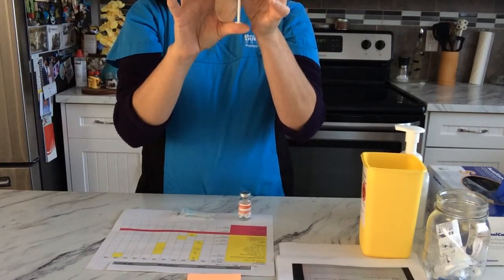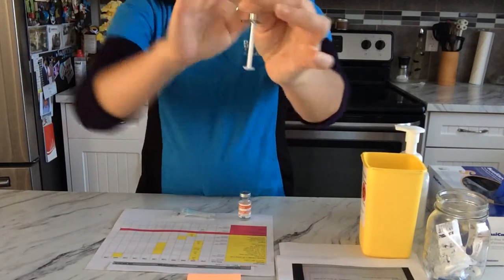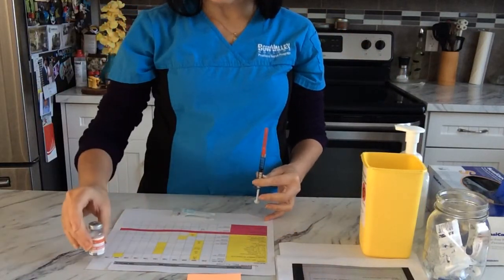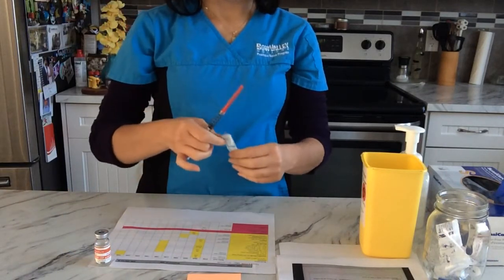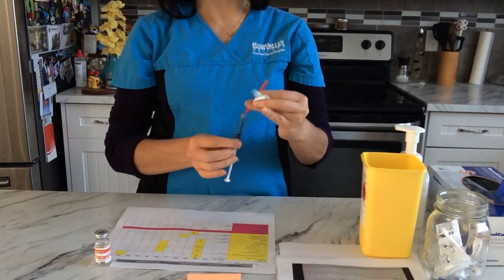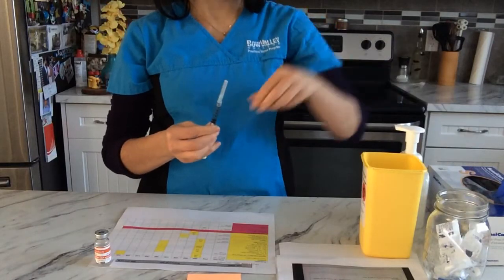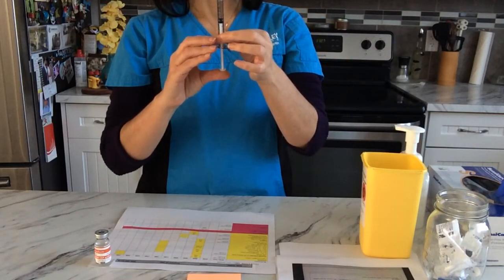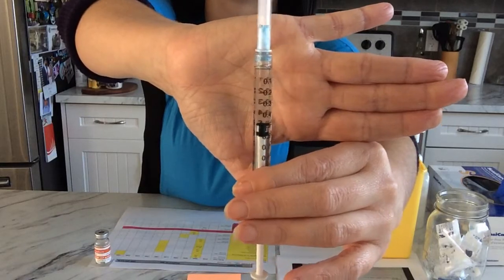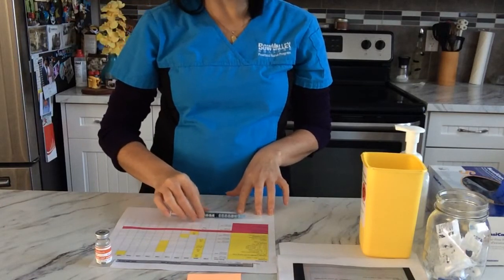Okay, I will change needles here first. I'm gonna discard this in the sharps container. 0.5 without bubbles.